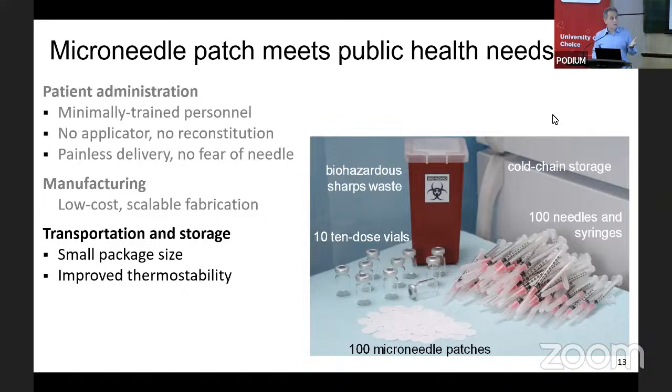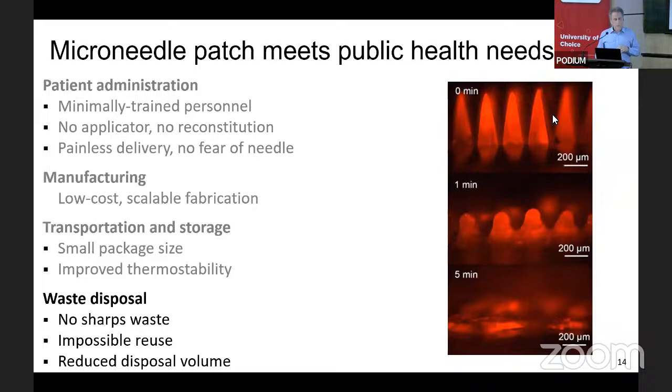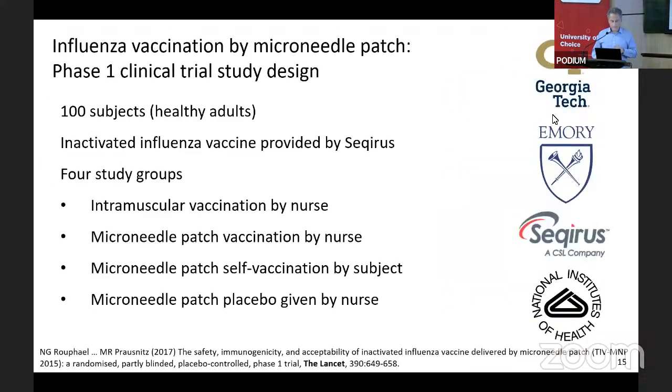We have the improved thermostability of this dry formulation, and in often cases can get either partially or completely out of the cold chain. From a waste disposal standpoint, the needles dissolve. So there's no sharps waste when you're done. There's no possibility of reusing these patches, unlike used hypodermic needles. And there's a reduced disposal volume for whatever does remain to be disposed of.